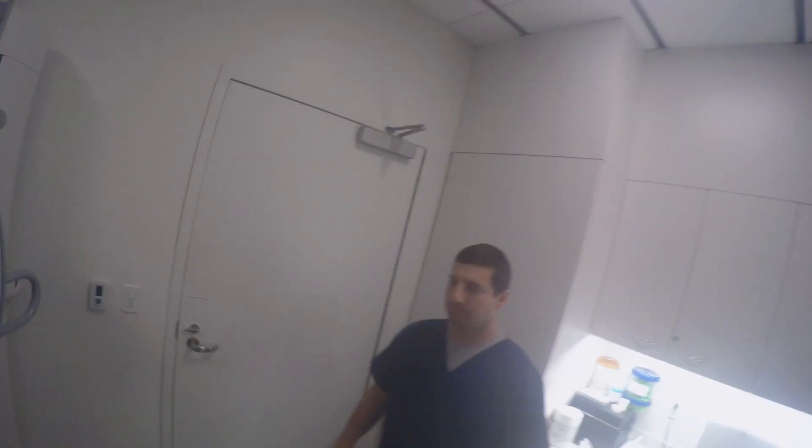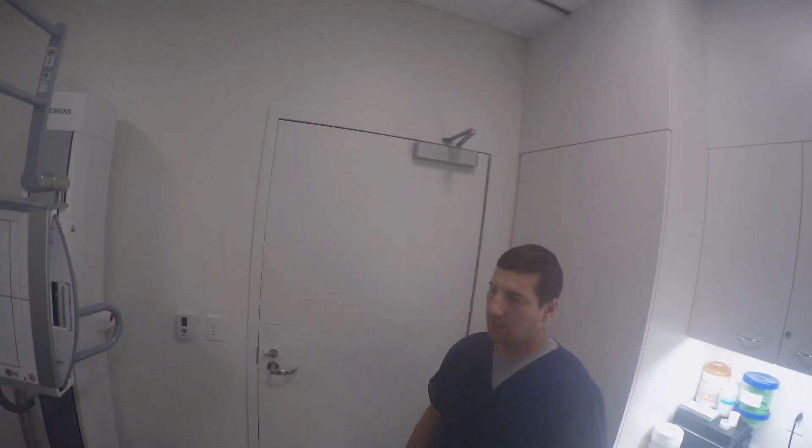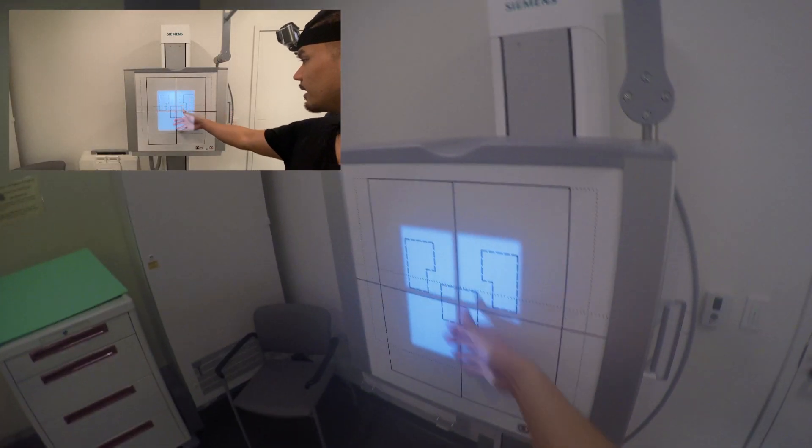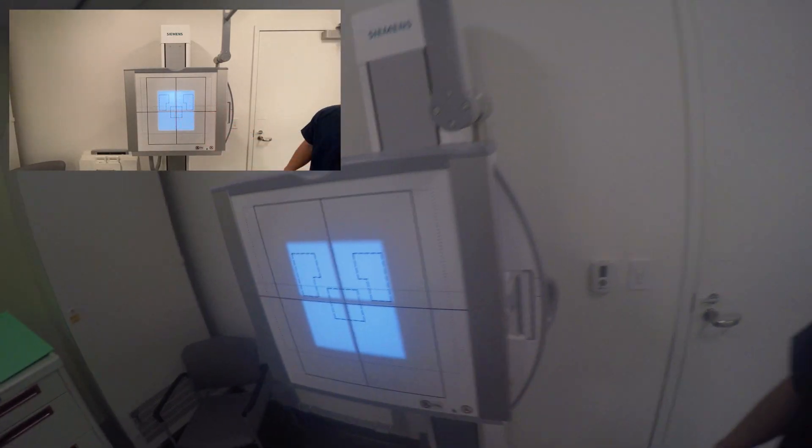Alright, so we're looking at your shoulder, correct? Yes. Which side are we looking at? Right shoulder. Okay, that's what we have here. Alright, great. So we're going to have you stand over here. Your right shoulder is going to be in this light field here in that cross. Your back is going to be against that board, okay?